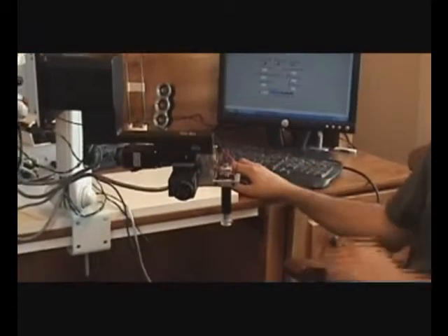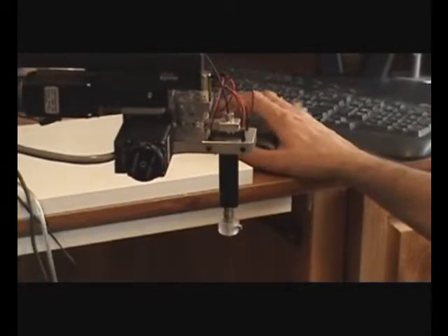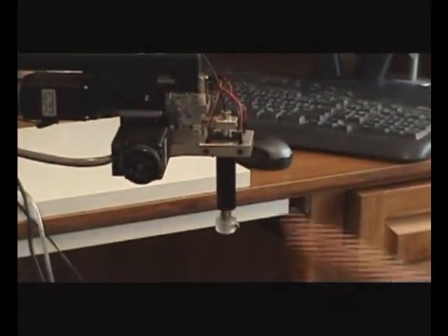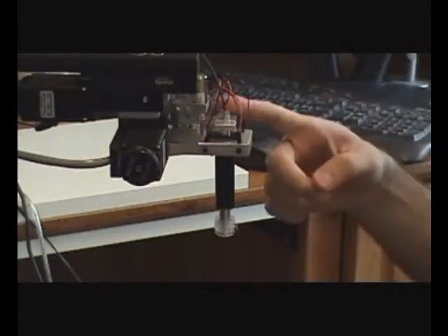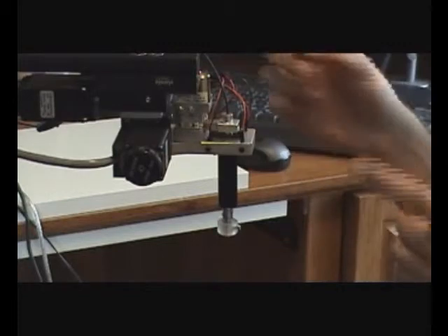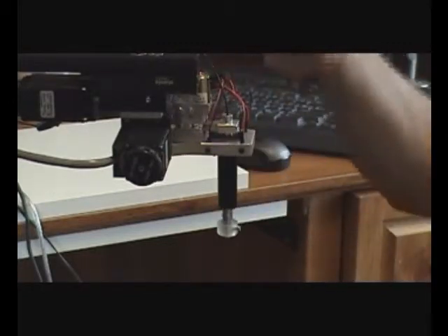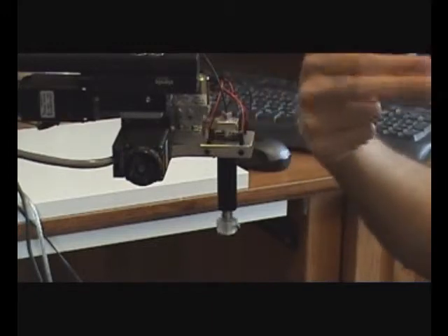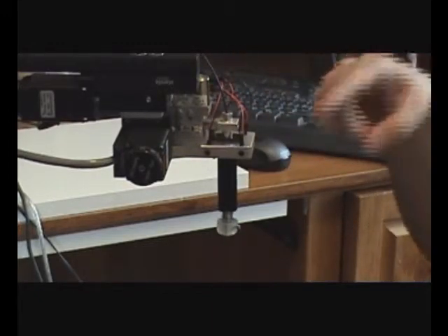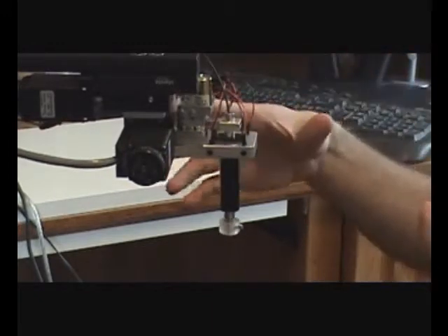Now we start the scanning, and as you can see, the solenoid initializes itself, and the first motor starts to move. Then when it travels its total travel, which is 8 millimeters, the second motor moves once in the Y direction, and this process repeats itself until it covers the whole area.